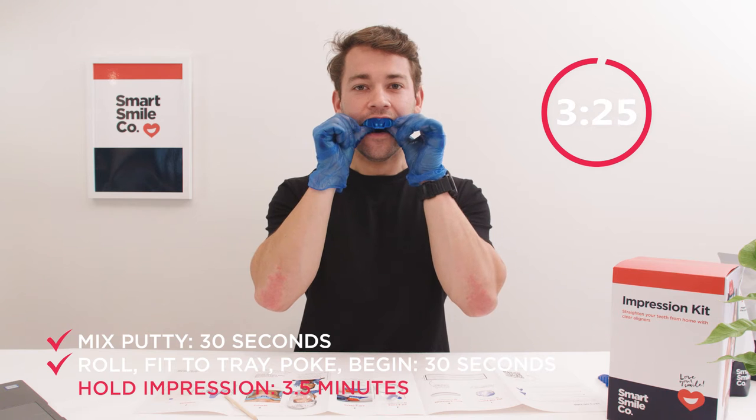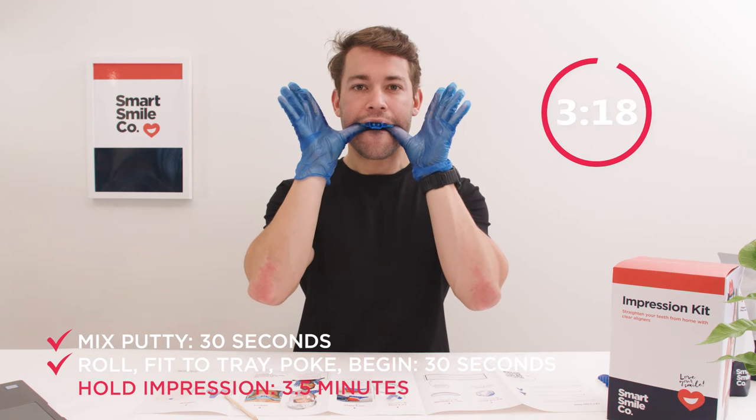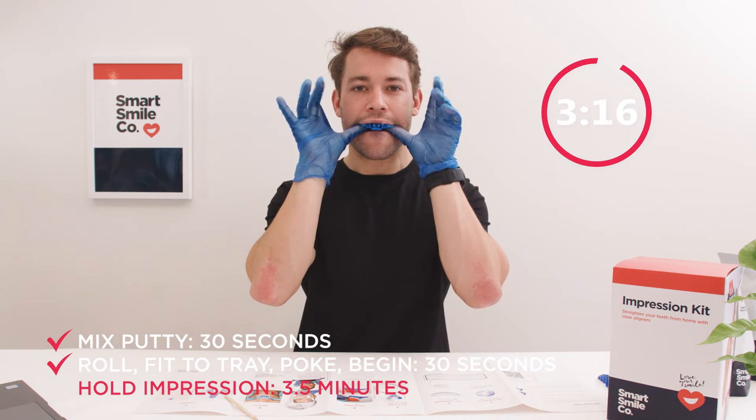Do not bite down into the tray. Also, resist the temptation to move your fingers and press in different places. Now hold the impression still until the countdown ends.